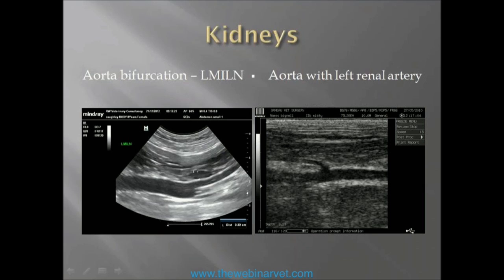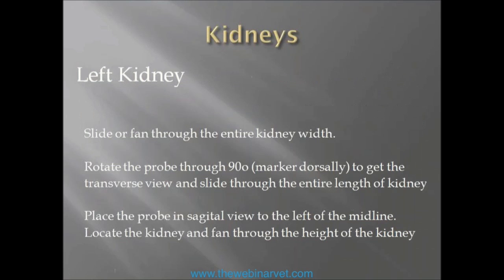You then slide or fan through the entire kidney width. Rotate the probe through 90 degrees with the marker dorsally to get the transverse view and slide through from cranial to caudal. Then place the probe in sagittal view on the body to the left of midline, locate the kidney, and fan through the height of the kidney.